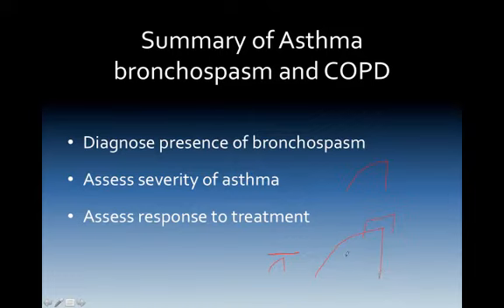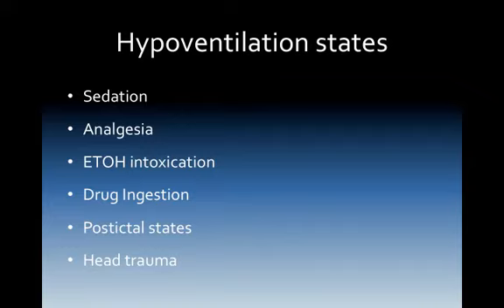Hypoventilation states, things like sedation, analgesia, conscious sedation, increase end-tidal CO2. We should watch for the need to intubate the patient or oxygenate the patient. In analgesia, same way. And this would be both in sedation and analgesia, that if we get increasing CO2s, we may need to increase their stimulation, either assist their ventilations or put them on oxygen.